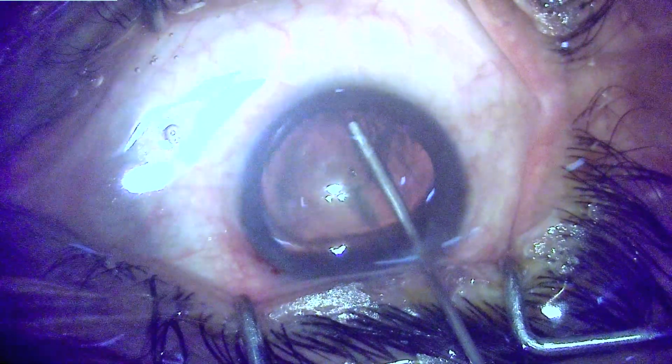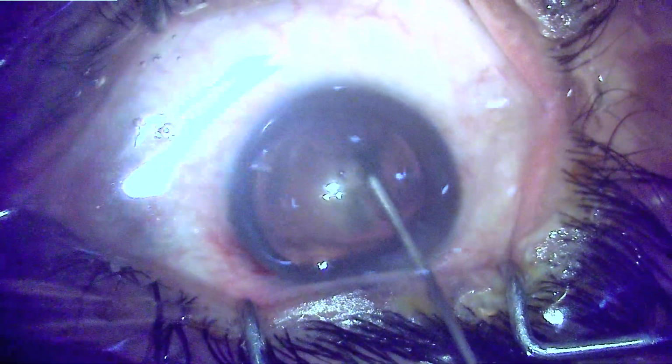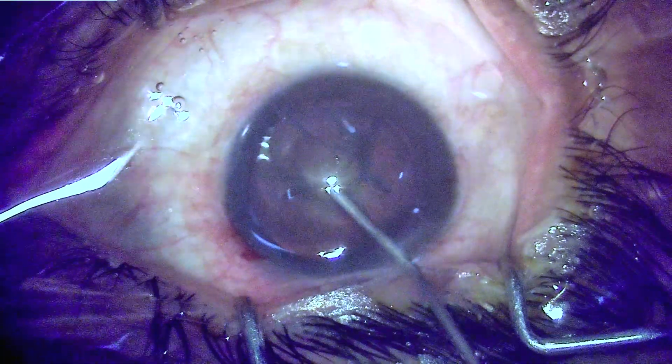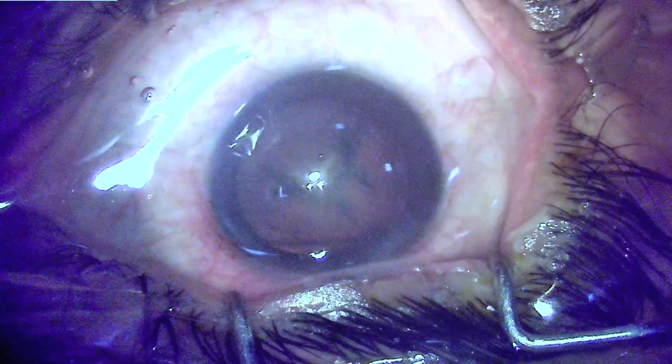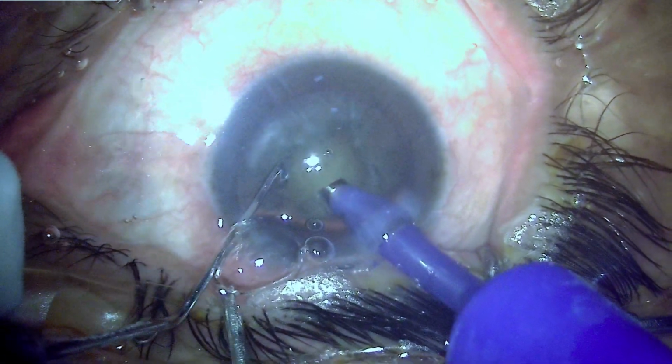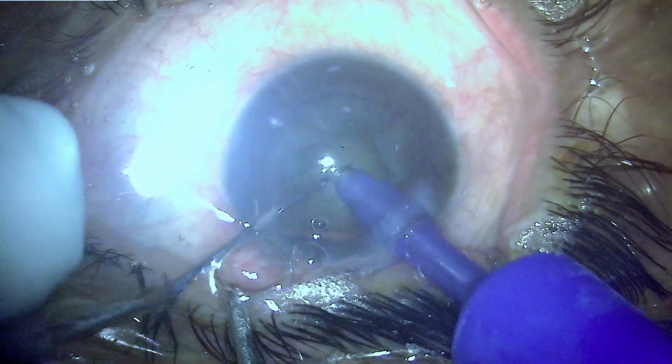Doing hydrodissection and hydrodelineation to define the nucleus. In nucleus grades less than 4, one can always define the nucleus which separates the epinucleus and the nucleus. Performing the surgery, going for the first chop.